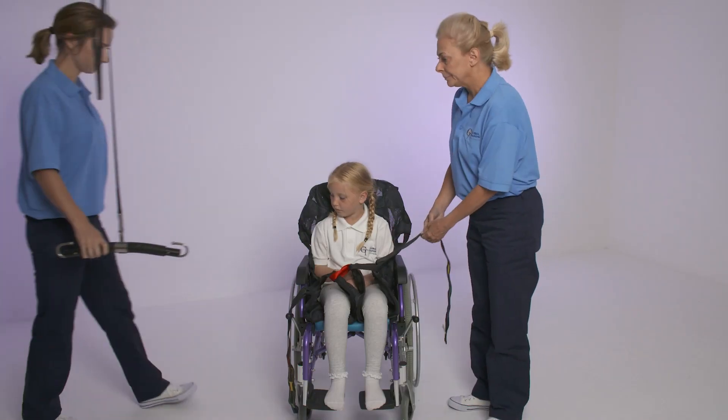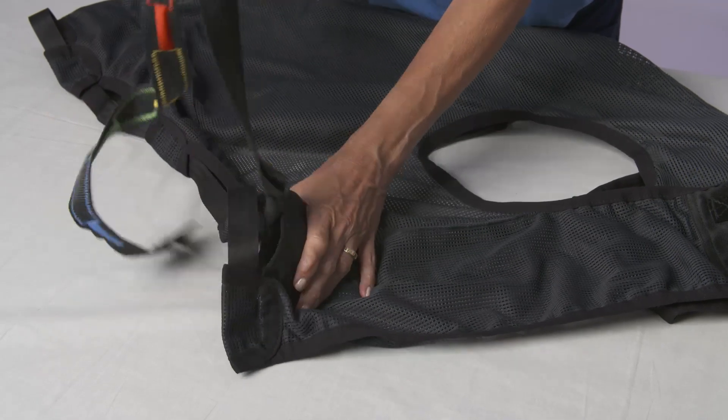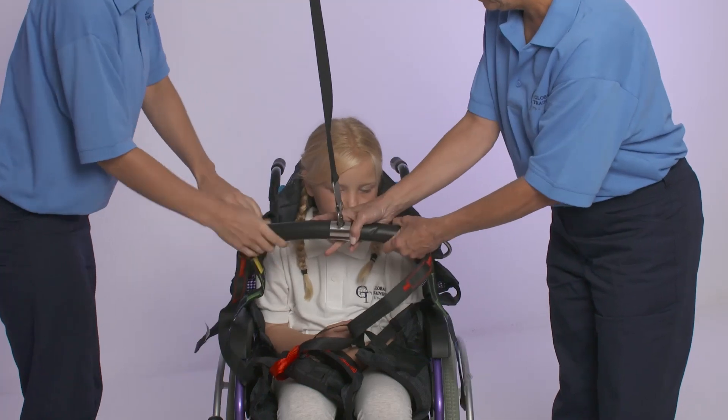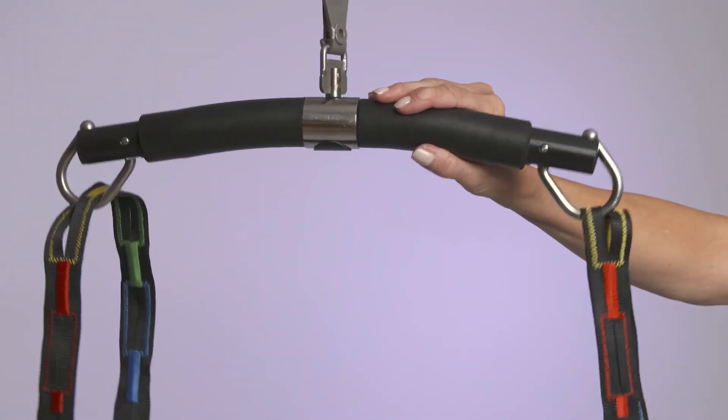And if a hoist is available, lifting straps can be unpacked from the side pockets and used alongside the top shoulder handles to create a hoistable sling. Color-coded connections provide a perfectly balanced lift.